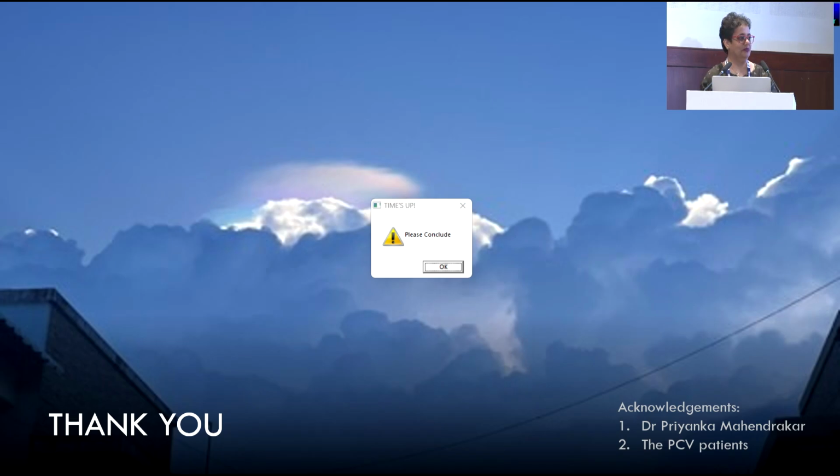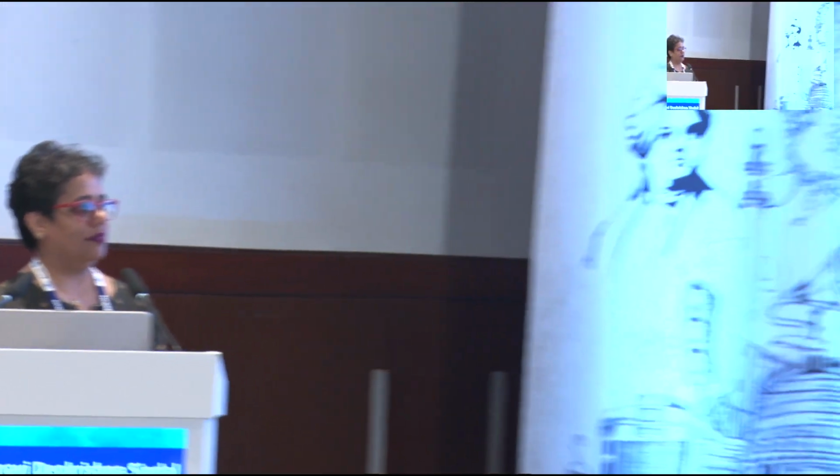So thank you, Manvi. I think that was a beautiful talk on PCV. In your practice, the majority of us now diagnose PCV quite reliably on OCT. Absolutely. So for the benefit of all of us, what would be the indications for ICG in a patient of PCV where you feel that without ICG you just cannot manage?